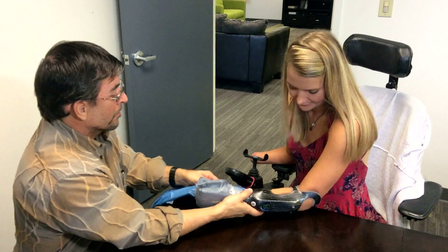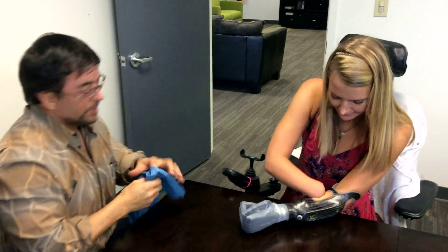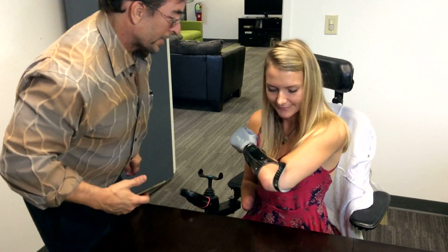It just needs time. Yeah, let me just move the skin around there a little bit, see how that feels. Much better. Yeah, that's better. Awesome. That's more like it. I love it. We do too.